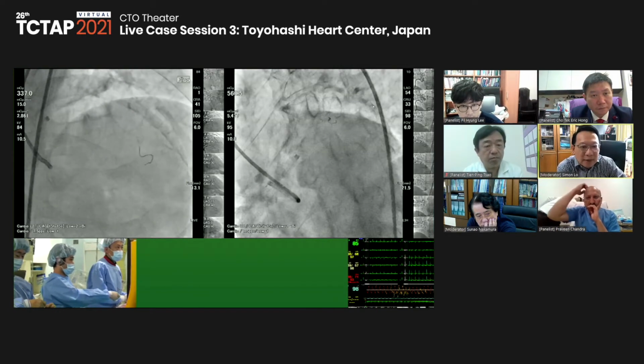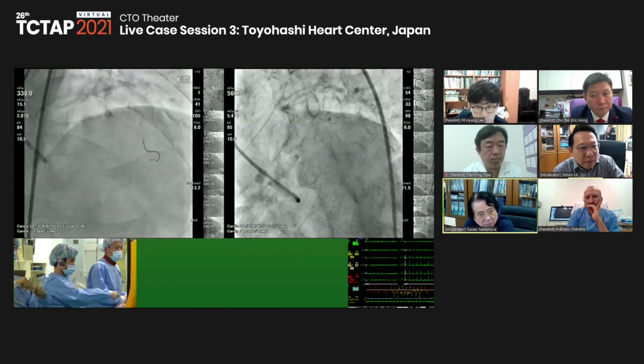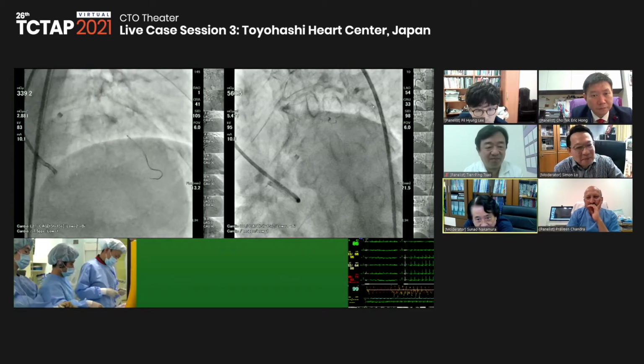Dr. Nakamura, can I just hear your comments as well, please? So he wants to start IVUS guided.